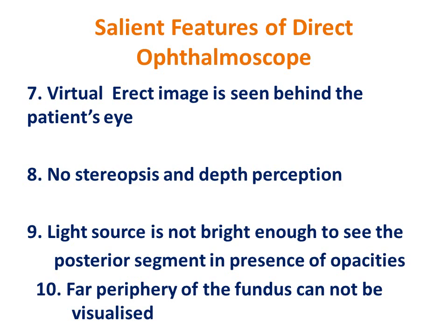Another disadvantage is that the far periphery of the fundus cannot be visualized properly, so you are likely to miss various peripheral retinal degenerations and peripheral retinal holes if you entirely depend upon this equipment to diagnose the posterior segment.